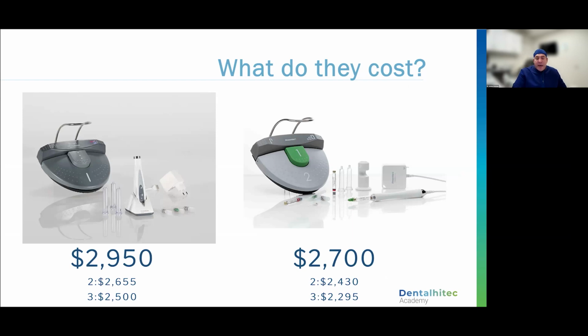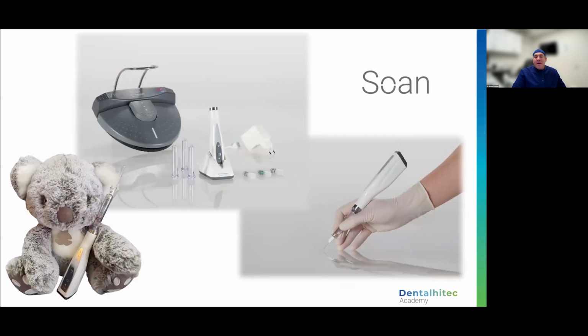Okay, and it's just the Sleeper One is a little less expensive. It's corded, and there is a bulk discount if you buy more of them. I don't know. It only says 3, maybe. If you buy 10 of them, maybe NuSmile at one time they'll give you a break. I don't know. Okay. The SOAN is, again, portable. It comes on that charging base, doesn't come with a koala, but the needles that we're going to use for both units are exactly the same, okay?